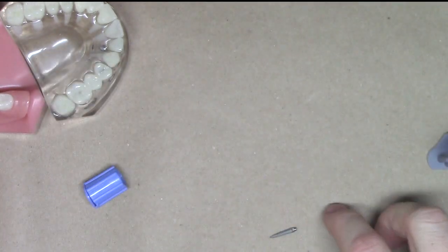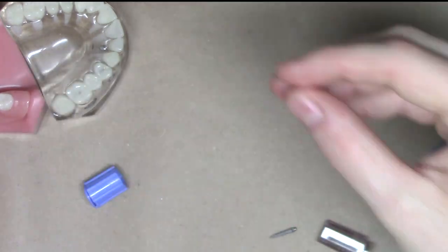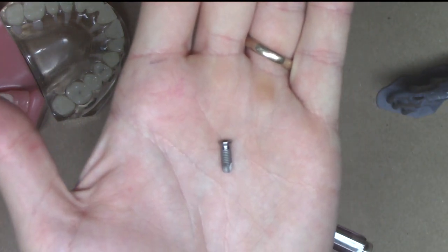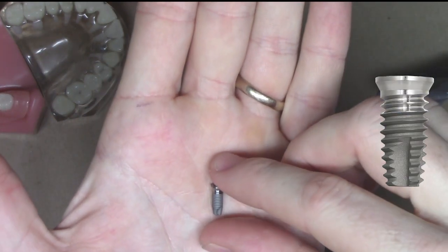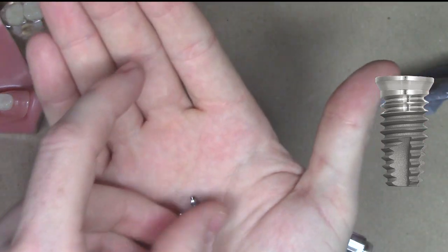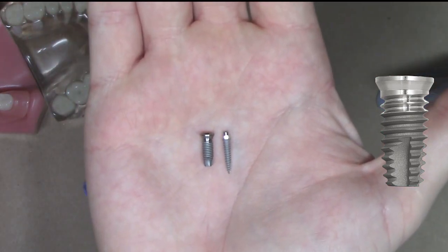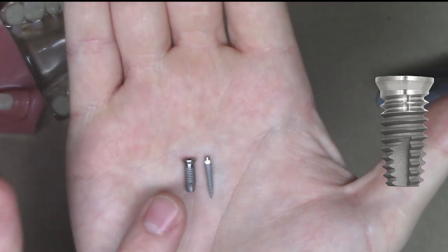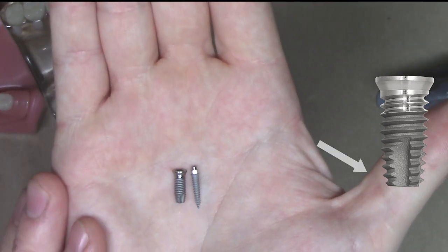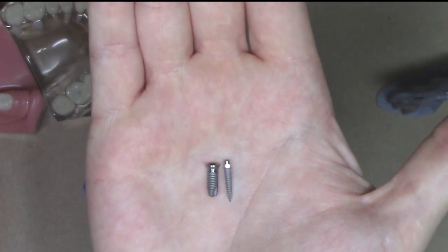And when I compare that to an existing dental implant, and this is just showing you sort of an older model of a Zimmer-Biomet type of implant. This is an XP platform. You can see when you look at the two of those that there is a significant thread difference between the two. The one on the left is the standard diameter implant. It has a much more conservative thread, where here with the narrow diameter implant you have a much more aggressive style thread, as well as this apical tapping end.